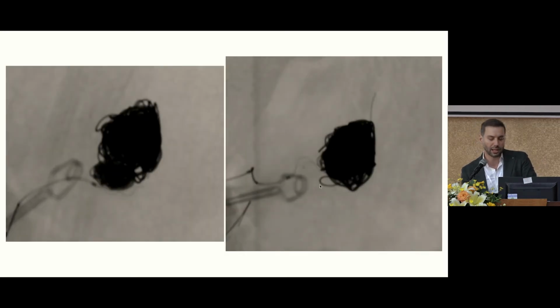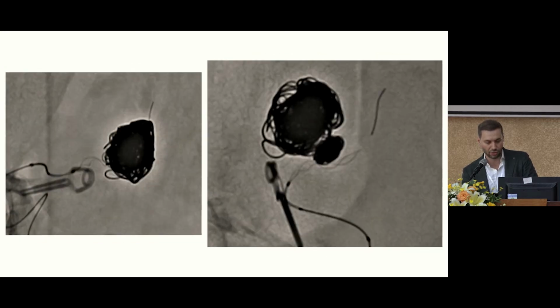It also helps and reacts as a flow diverter stent also. So you can see the deployment, how it respects the anatomy, taking the anatomy of the vessel. This is the control after the procedure. You can see somehow a bit of filling at the aneurysm neck.